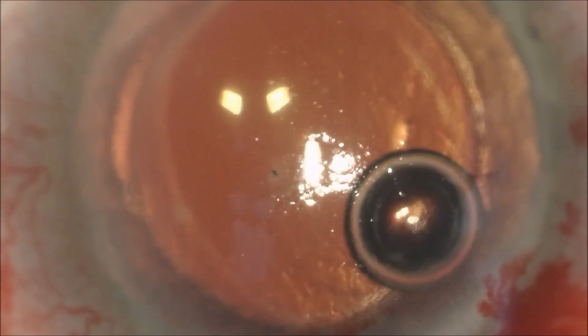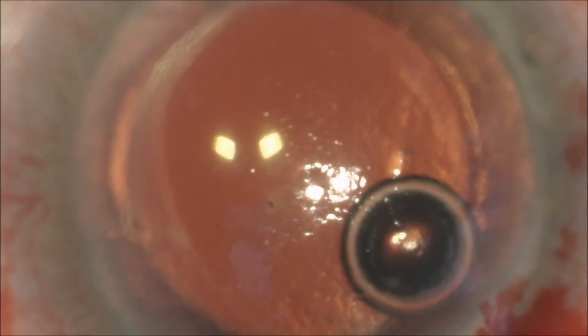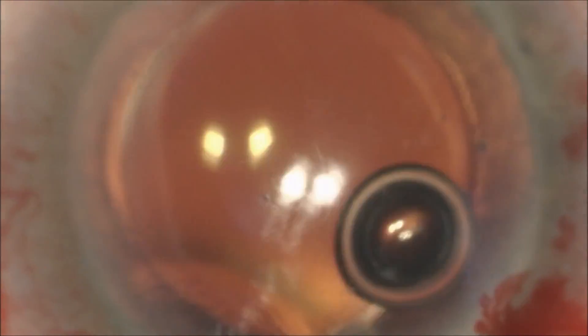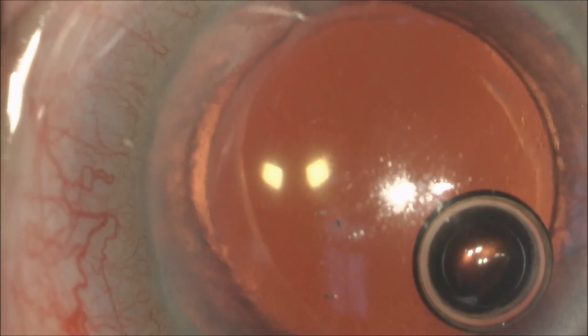Going back to the anterior surface of the eye, you can see that the cornea now has had the majority of the bee stinger removed and the corneal surface appears smooth. As we irrigate the cornea, we will now remove the viscoelastic and seal the wounds with balanced salt solution. Here's a picture of the patient taken approximately one week later with the majority of the inflammation gone.